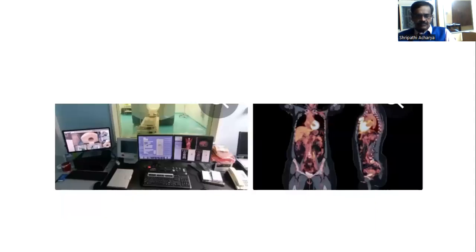On the left side, you can see the computer screen, which is taking images of the body in different planes: in the frontal plane and in the transverse plane. On the right side, you can see the scan photo. In the frontal plane, the organs are viewed.